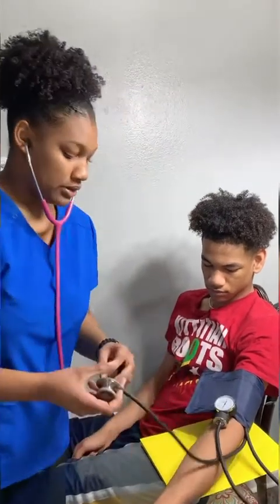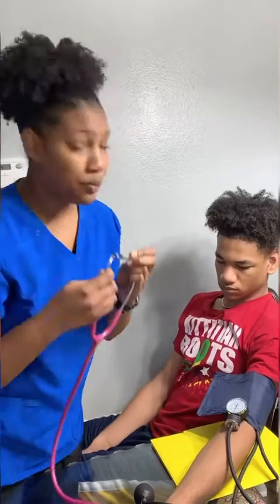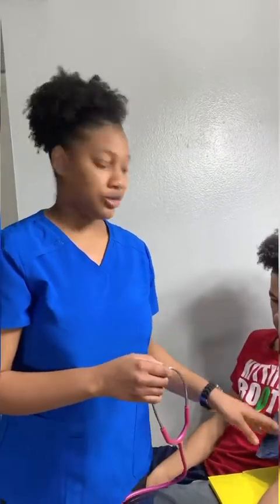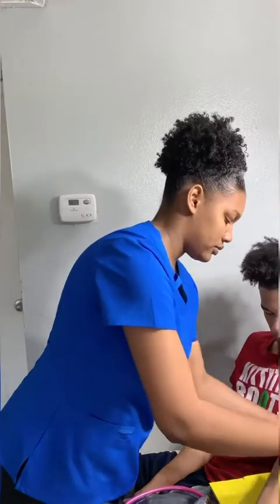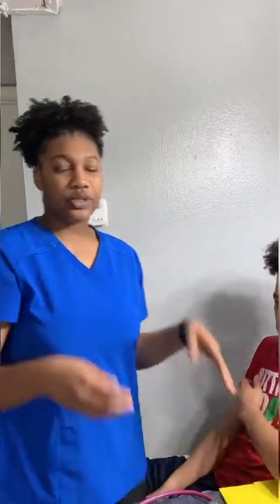Okay, so it's done. His blood pressure was within normal limits. It was 110 over 70 millimeters of mercury, which is within the normal limits. So I'm going to remove the cuff. Okay, now the normal is around 120 over 80 millimeters of mercury. If it was abnormal, the nurse would have to look for interventions, so probably medications or different interventions to get that blood pressure within the normal limits.